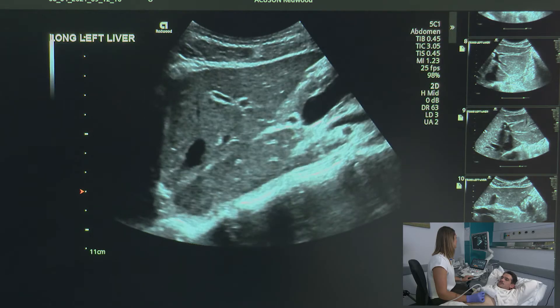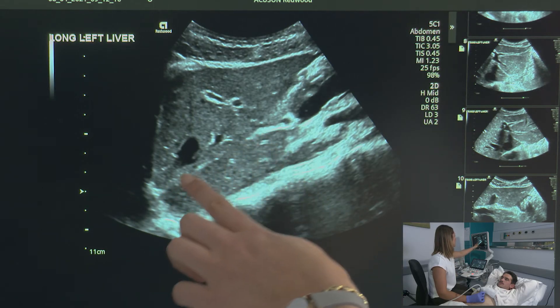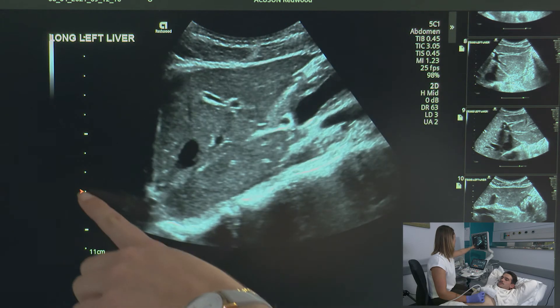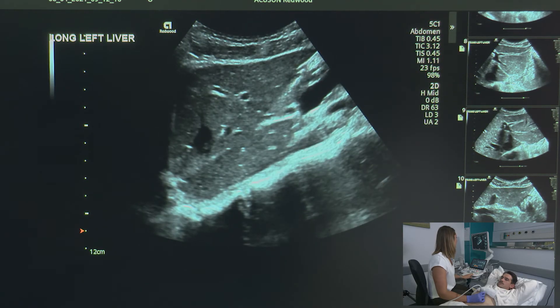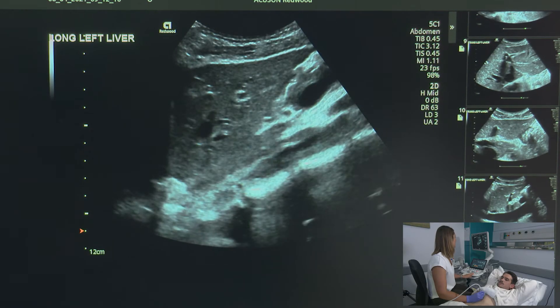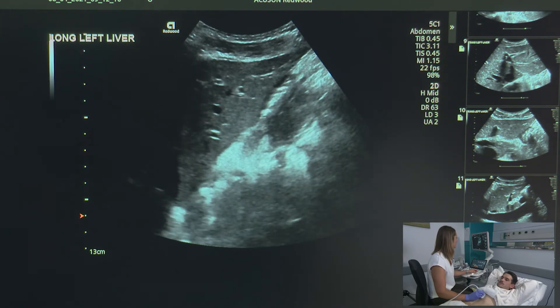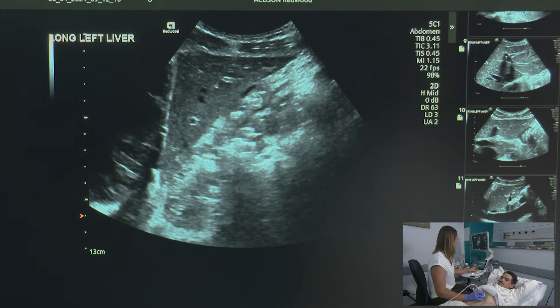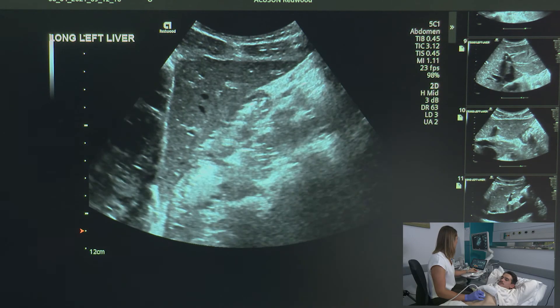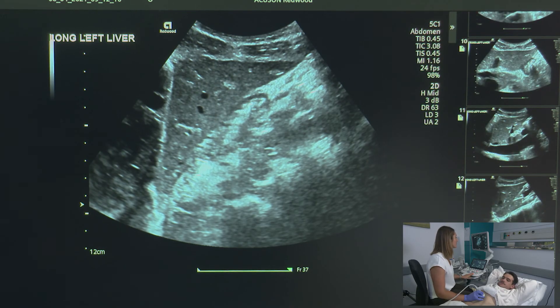The next thing I'm going to take is making sure that I show the caudate lobe. You can appreciate the ligamentum venosum right there — that echogenic line. I'm only going to adjust my focus so that it's sitting just posterior to my liver, and we'll take that image. The last one is going to be of the left lobe of the liver — I like to call it the flag shot. Big breath in. We're demonstrating the tip of the left lobe. We can increase our gain and decrease our depth, with the focus sitting just posterior to the liver. We want to make sure we don't have any movement from the heart. And those are all the images we need to take of the left lobe.